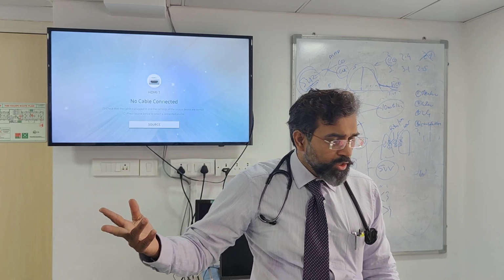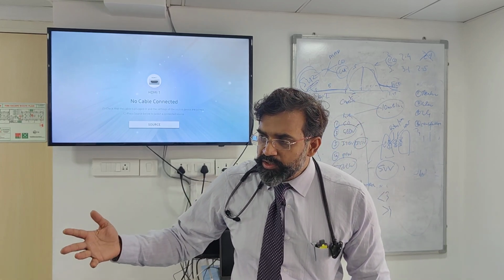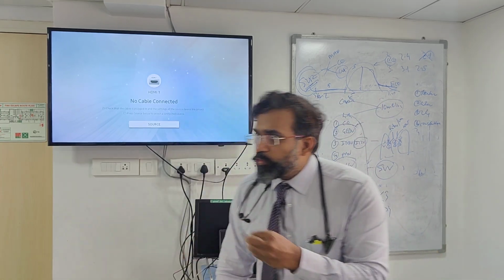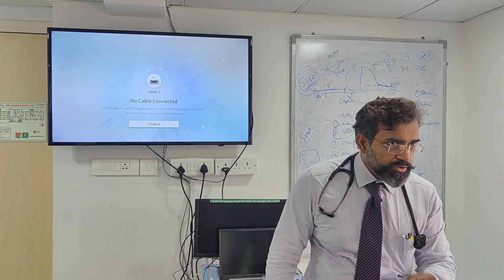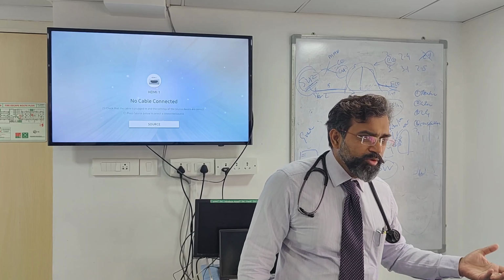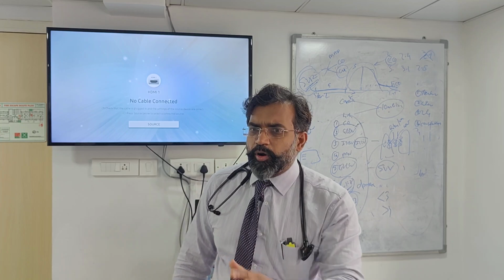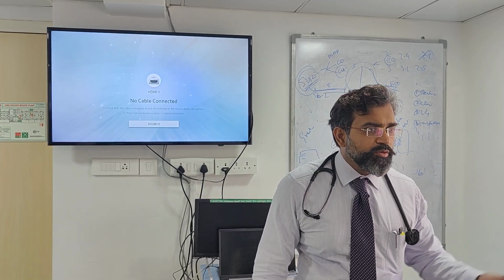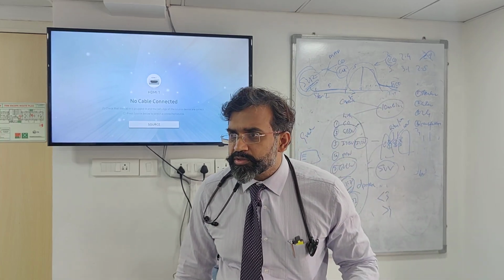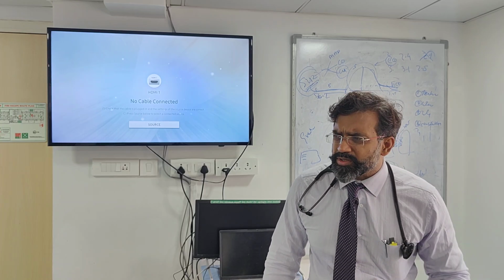So, what happens when there is ECMO? What happens when there is intermittent hemodialysis? If the blood pump flow is more than 20% of the cardiac output, then you can't use this. Our flow in CRRT is 150 ml, so it's not a problem. But if the blood pump flow is more than 20%, it may become a problem. The problem comes with ECMO, where the flows are 3 liters, 2 liters, 4 liters. So in ECMO you may not be able to use this, but conventional CRRT you can use, no problem.